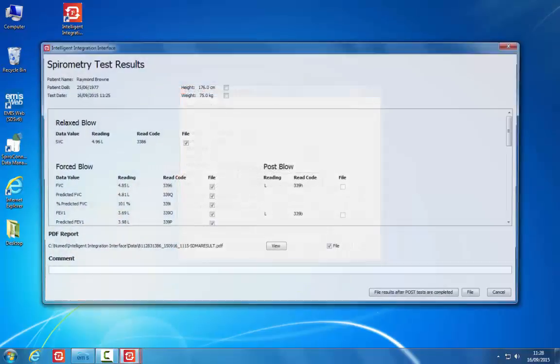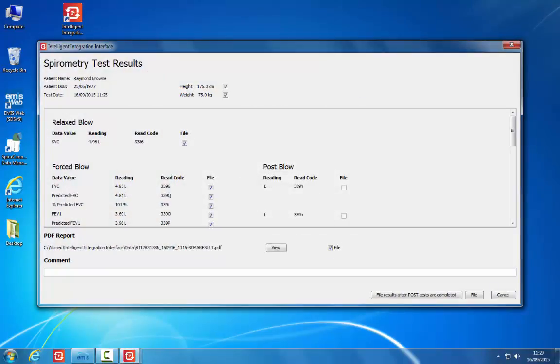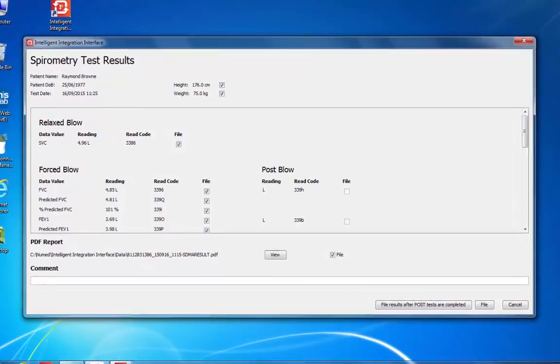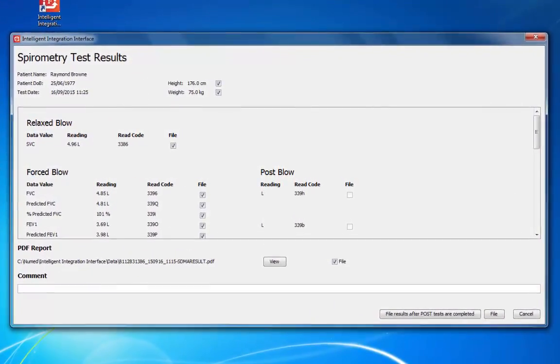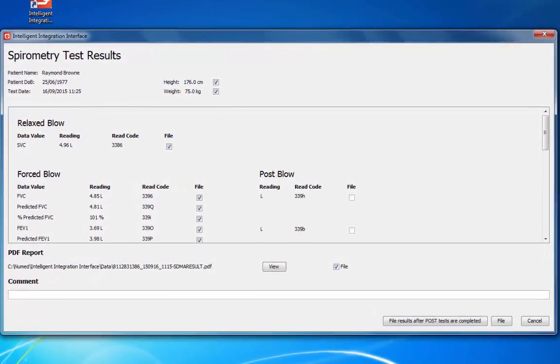A message will be displayed indicating the results are being exported to the i3 software. As the software closes, the spirometer switches off automatically, prolonging the battery life. The device will also switch off after around 5 minutes of inactivity, but can be powered on again without loss of data by pressing the Power button. The i3 software will then present the data values available for filing to the patient record in the clinical system.